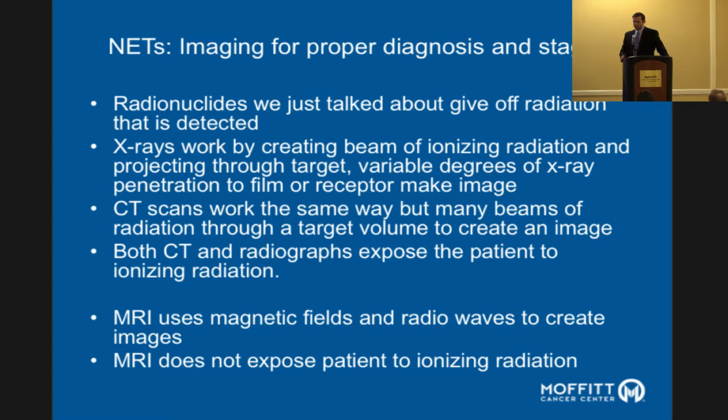Now, these are some of the nuclear medicine things that are specific to neuroendocrine tumors, but as a patient involved in our medical system, you're going to be getting things like X-rays, CT scans, and MRIs. I just want to touch a little on that, give you a little frame of reference, and then talk a little about radiation dose, because I think that's something of interest to people when they're getting all these scans, some kind of frame of reference and a little bit of information about that.